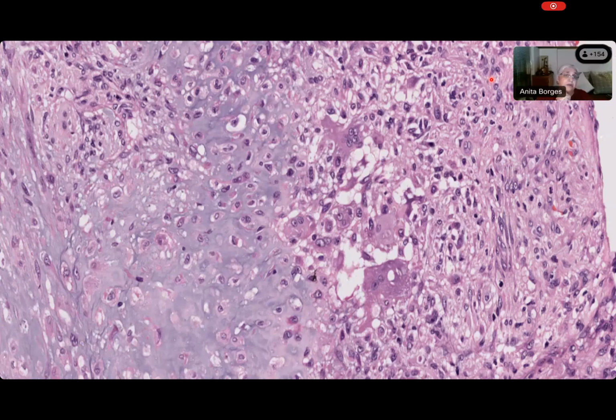Again, you are going on about color. Color, I told you, is very, very dependent upon what? Calcification. Well, if there is calcification or there is pH. Okay. So now please tell me why do you think that this is cartilage? Come on. Prayas, please tell Hema why this is cartilage. Because it's blue? No. Why is this cartilage? Chondrocytes. Because chondrocytes, there are lacunae. So this is cartilage.